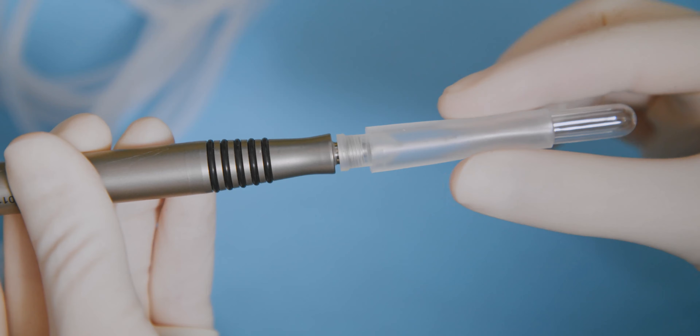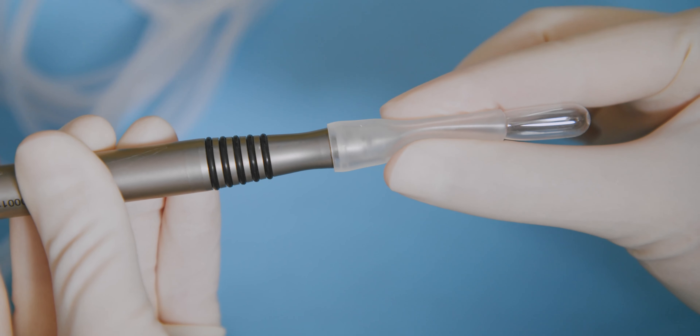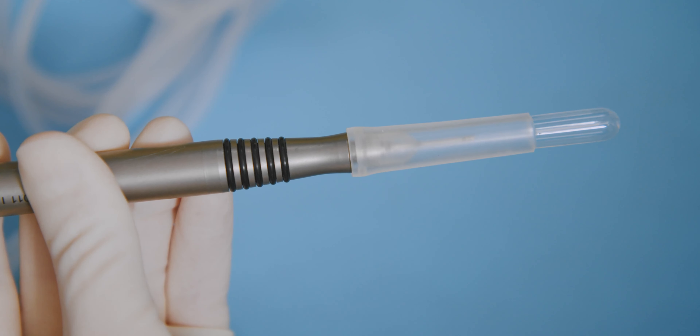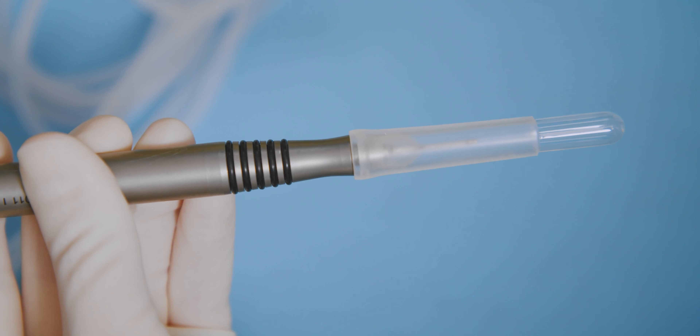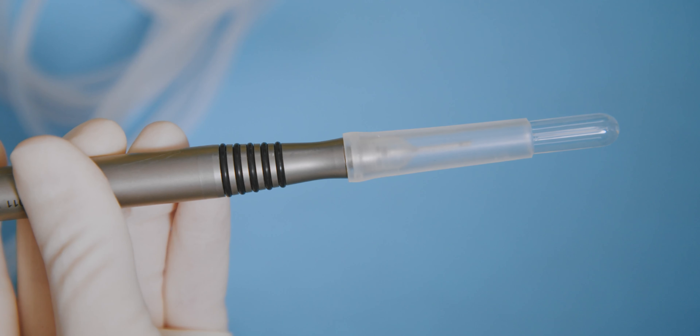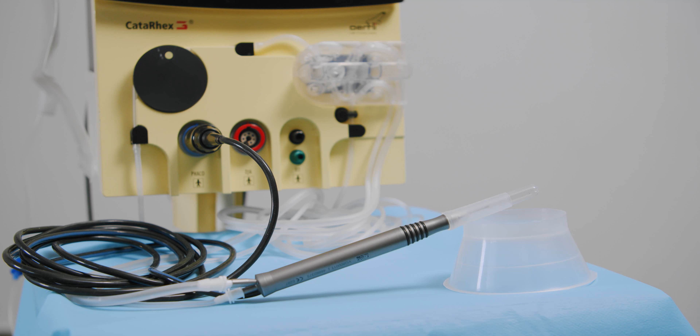Secure the test chamber over the irrigation sleeve. The irrigation sleeve must come up to the bevel of the tip. Pull the test chamber over the tip and sleeve until the back end is flush with the irrigation sleeve. Place the handpiece at a 45 degree angle to ensure optimal priming.